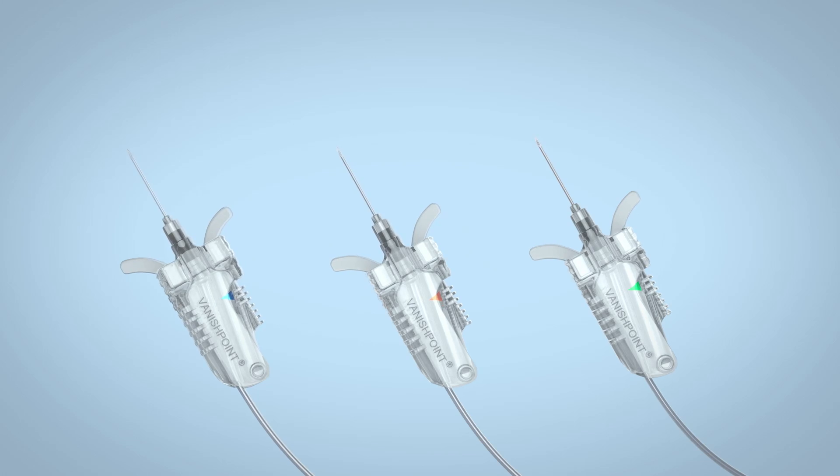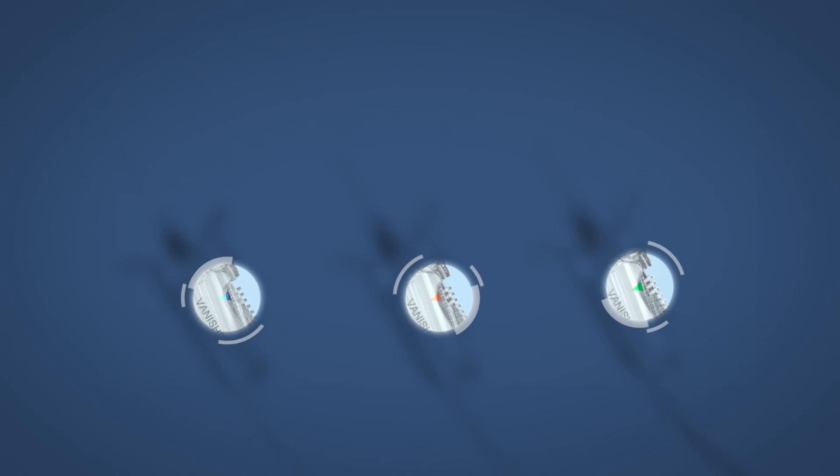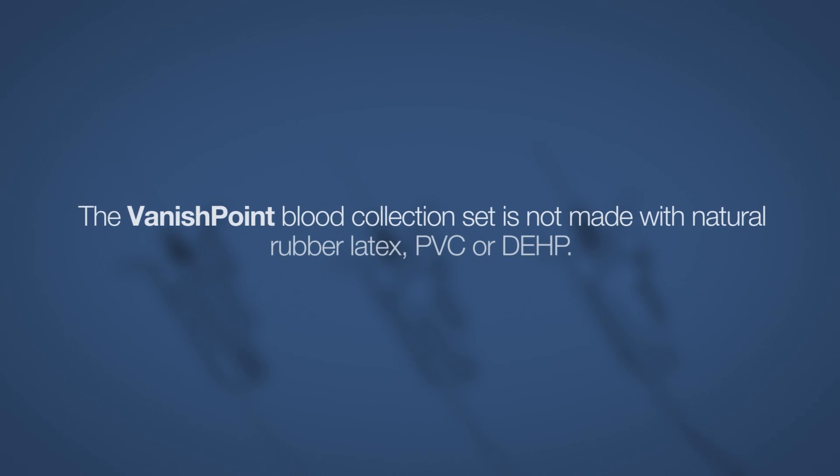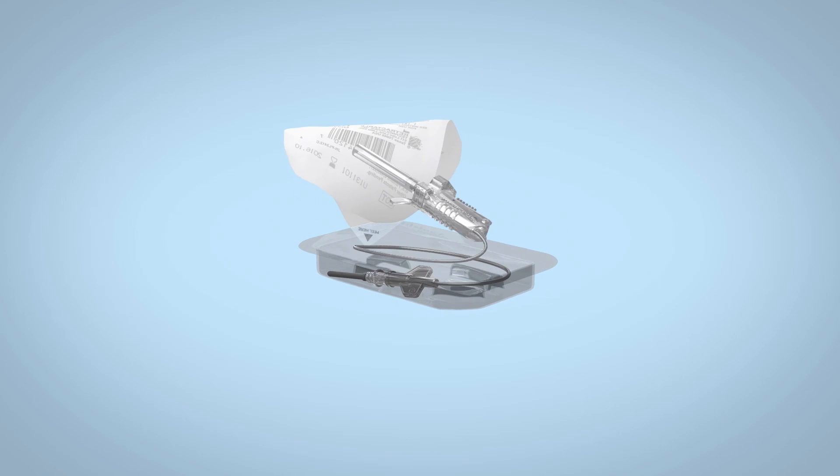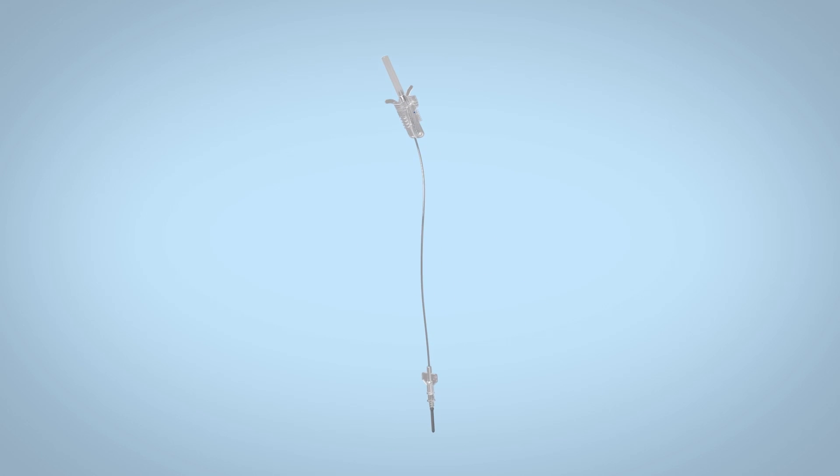The trigger indicator is color-coded for needle gauge. The Vanishpoint Blood Collection Set is not made with natural rubber latex, PVC or DEHP. Kink-resistant tubing is available in 7 and 12 inch lengths.